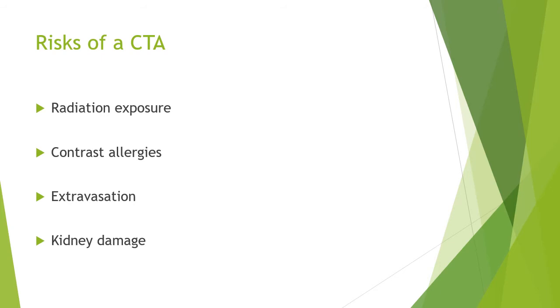There's also a risk of contrast extravasation. With any IV exam, there's a chance that the contrast leaks into the surrounding tissues instead of through the intended vessels. Contrast can also be harmful to the kidneys because the contrast is filtered through the kidneys, so if the kidneys aren't functioning well enough to process the contrast, there could be adverse effects.